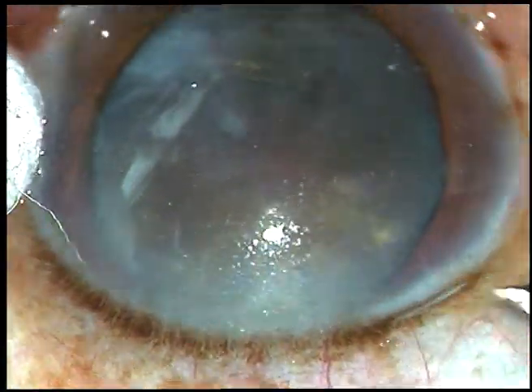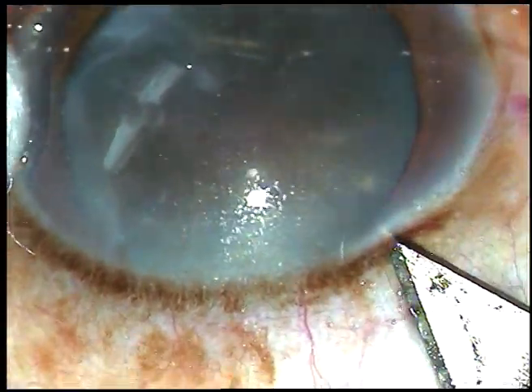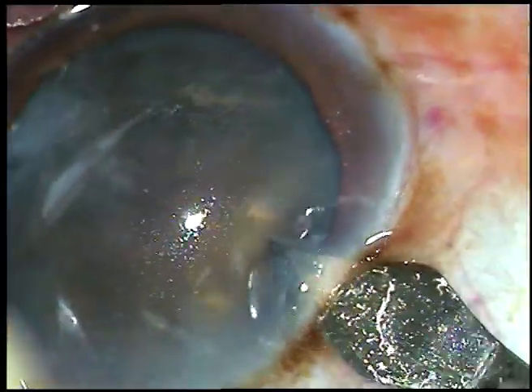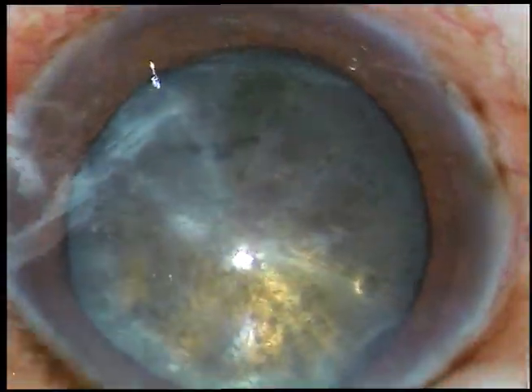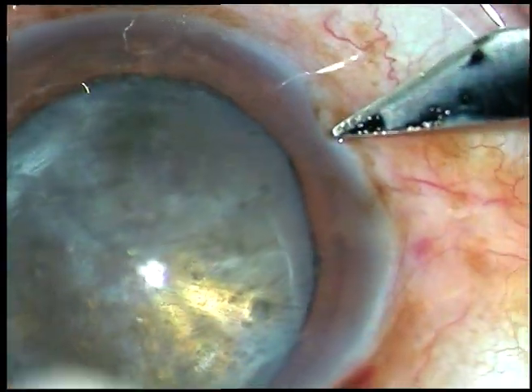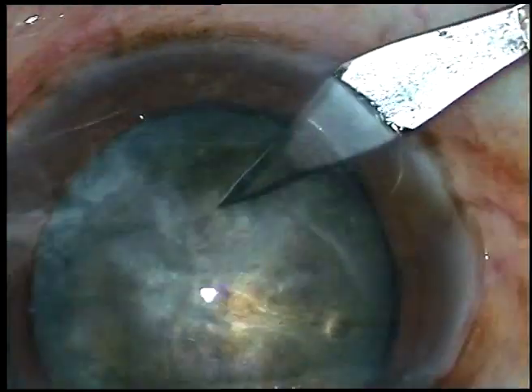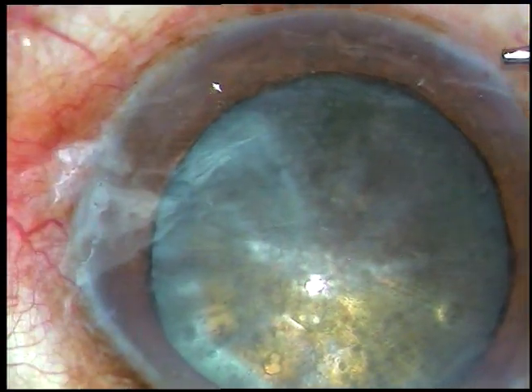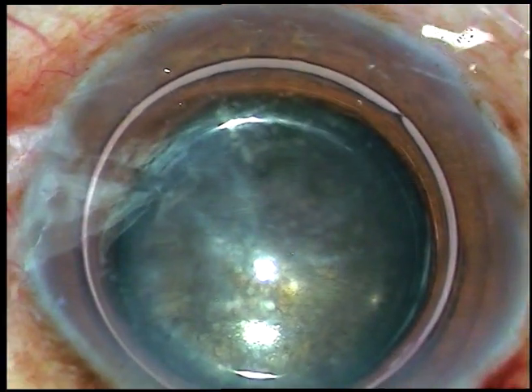Dear colleagues, this is a very hard cataract. Let us see the surgical steps. The main incision has been placed at around 10:30 o'clock. One sideport has been made at around 8 o'clock.